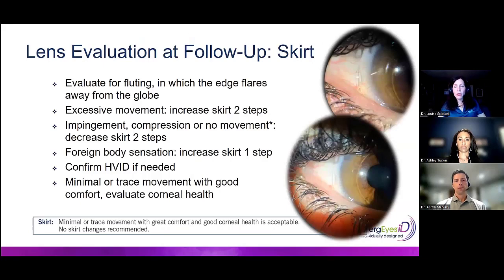The top image shows a fluting and more so than the bottom image, but we do see some fluting. You see this at 9 o'clock. If you do see fluting, that's going to be uncomfortable. We do need to increase the skirt. So again, remember, increasing the number will make that skirt tighter, and it will get rid of that fluting.